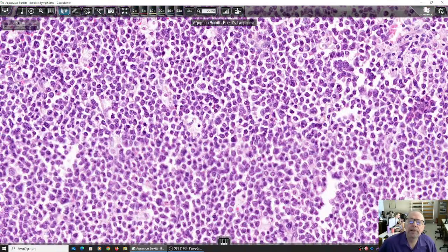This one, for example. Could this be? What does it lack to look like a malignant cell? How do you expect a malignant cell to be? Don't respond too quickly, so that there is not enough time for me to show other slides and you'll have less.